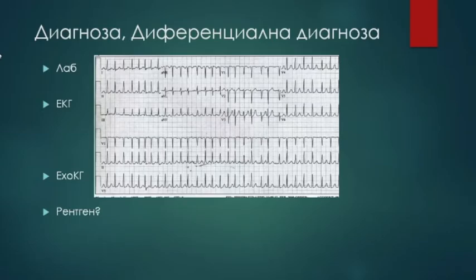Can somebody try to interpret it? First, what is the rhythm? Looks like it's in sinus rhythm. Looks like, but is it? Is this a P wave or a T wave? It's a T wave. Yes, so it's not a P wave. Are the RR intervals constant, equal or something?